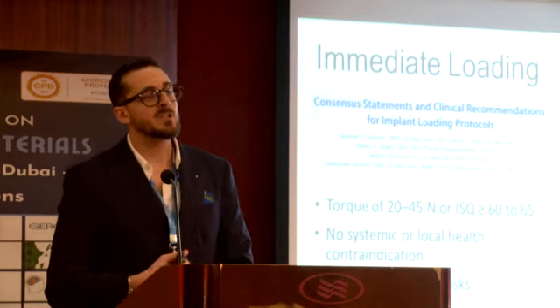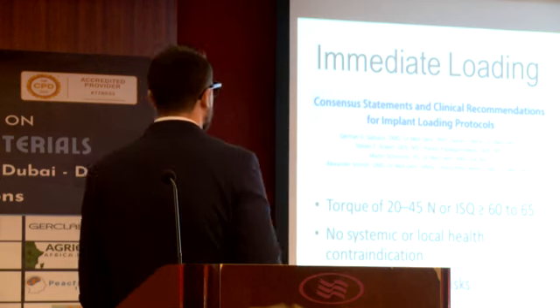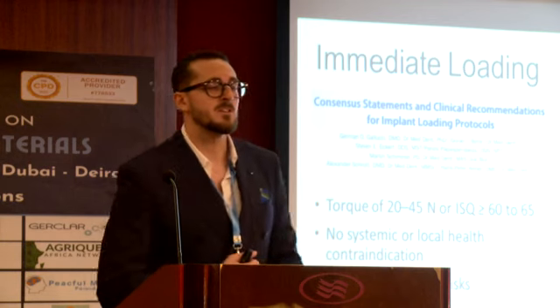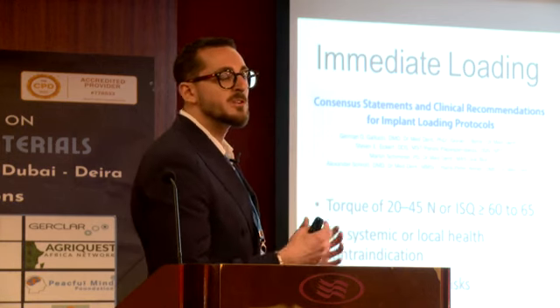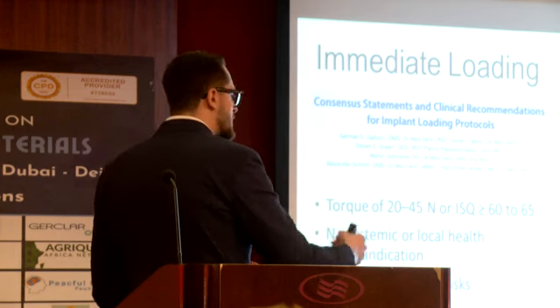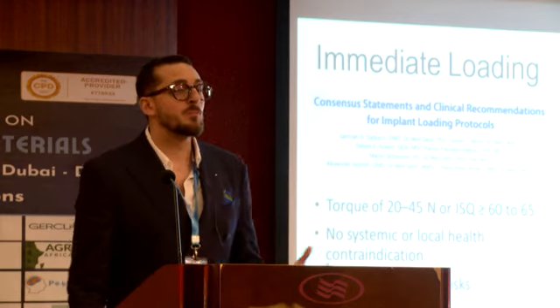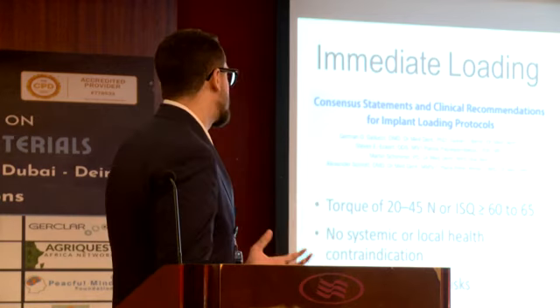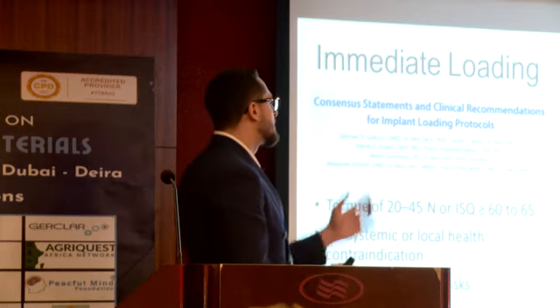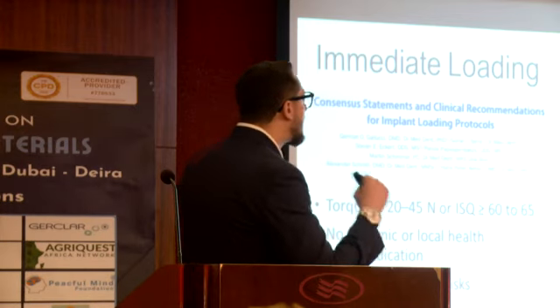Then the last step is going with the immediate loading. What we know about the immediate loading from the last ITI consensus statement is that we need at least a torque value of 20 Newton or an ISQ value of 60. If there is no bone defect, we can easily practice it. It doesn't affect the osseointegration of the implant, and we are having more benefits and basically no risks. The most important benefits are the enhancement of the quality of the soft tissues, and we are just stabilizing the soft tissue.